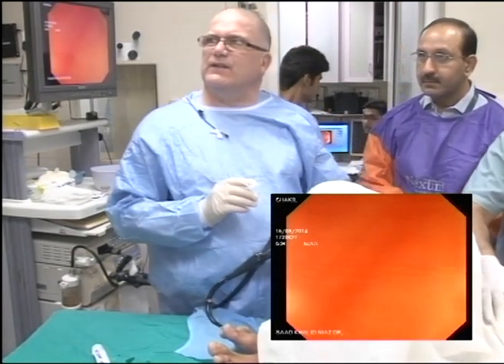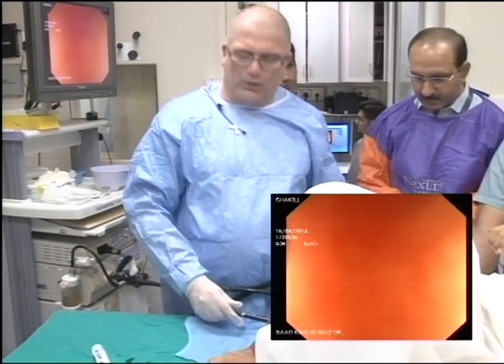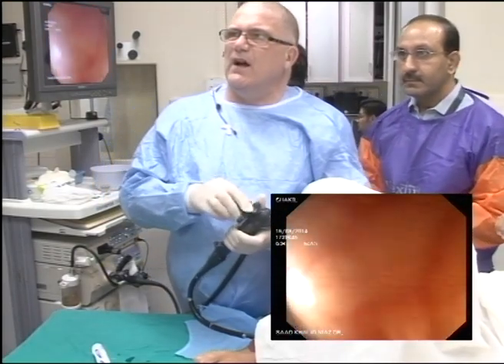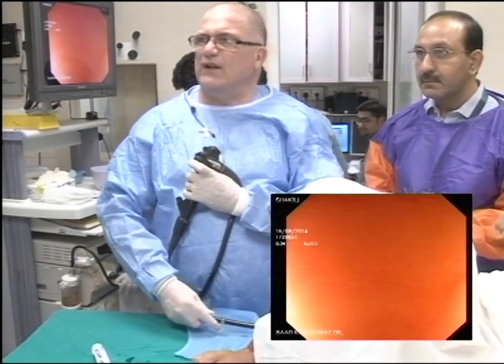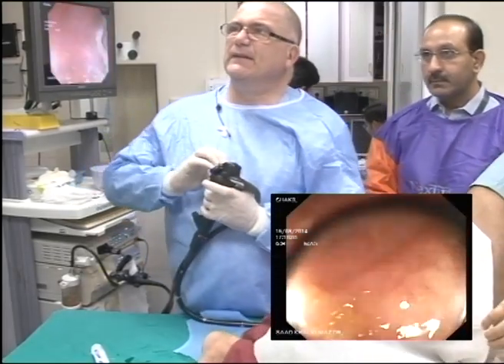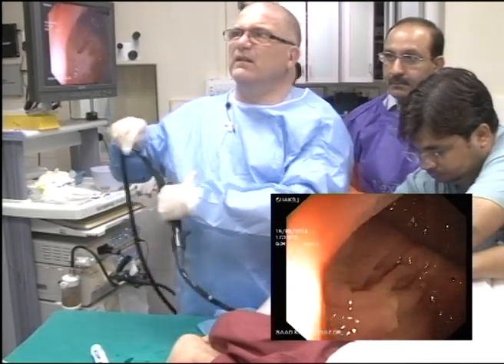and it's stuck at the hepatic. And I know that if I put this torque into the scope, I'm actually using the torque in my favour as I draw back the scope. Transferring a loop into the umbilical isn't a problem. The problem is that what's outside represents what's inside, and I'm trying to keep the scope in a straight line so I can actually intubate the colon itself. What I'm going to do now is ask him to go back onto his left, and then all should become apparent. After you're done with this case, just while we are all watching you, we'd like to see you put a loop into the umbilical cord, and then how do you reduce it?